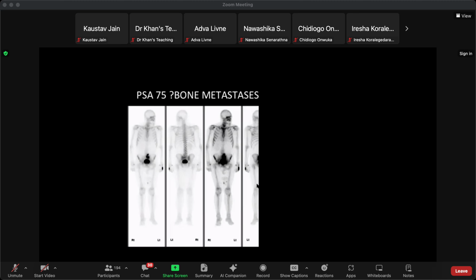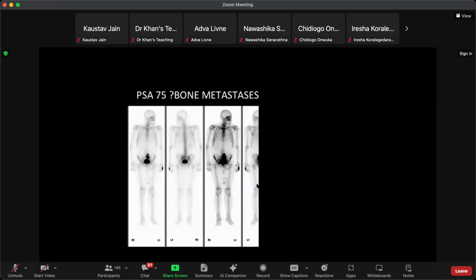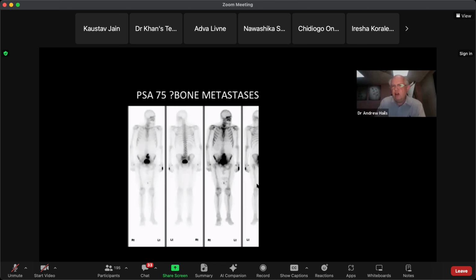It's exactly the same density as the bladder and is close to it. I wondered whether this could be a bladder diverticulum, but I can't get a connection. Well, I think that's quite a good idea. An oblique view could help. I can see that there's been extravasation at the injection site as well. Okay, well that's fine. I think bladder diverticulum.